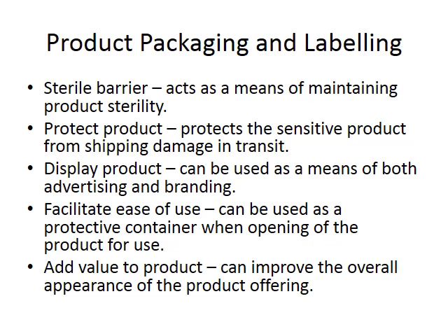The product packaging should act as a sterile barrier, and this means that it maintains product sterility until it's needed for use. It protects the product during transit and during storage. It displays the product easily so that staff know what they're picking up off the shelf. It should facilitate ease of use, and it should add value to the product. And these are very important.